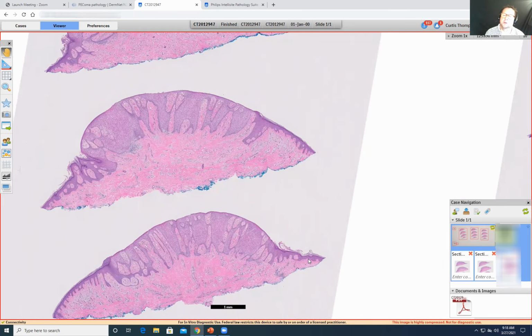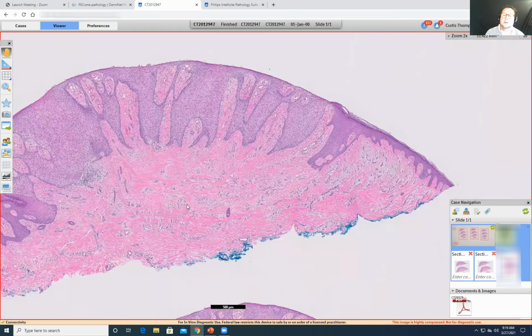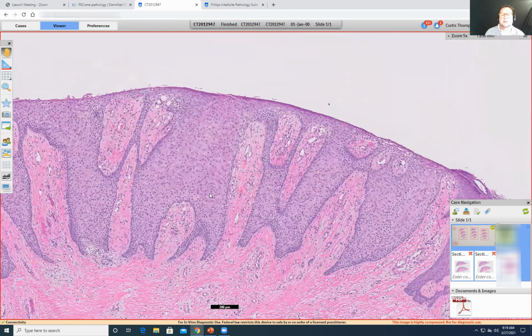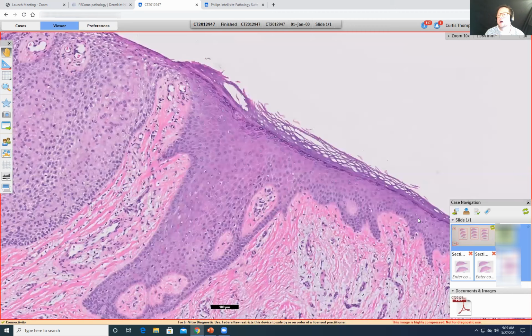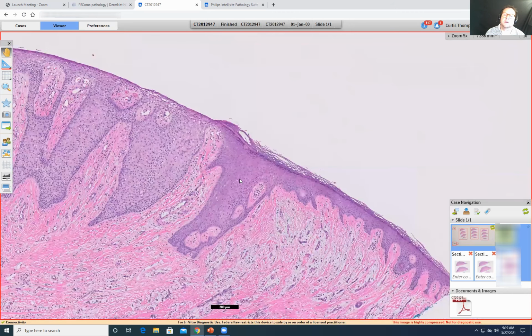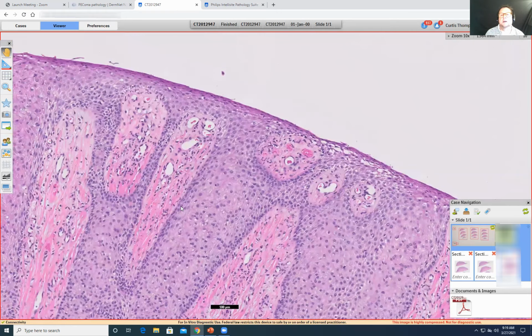Here we have normal epidermis, then going into the very center, very, very acanthotic, psoriasiform-like change, and then going back to the thin. So here's our lesion, maybe some fibrosis under it for sure, but look at this, see these pale cells. So we're stepping off nicely from the normal purple staining epithelium into this pale, clear component.